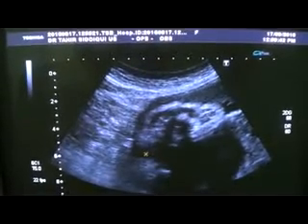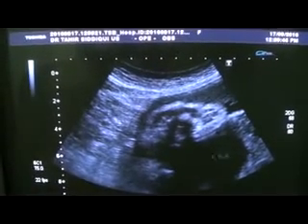I am scanning this patient a second time in three days to rule out whether this is an extended urinary bladder. Here you can see this is the urinary bladder, and this is the cyst that extends up to the liver of the fetus, or more appropriately, up to the epigastric region.